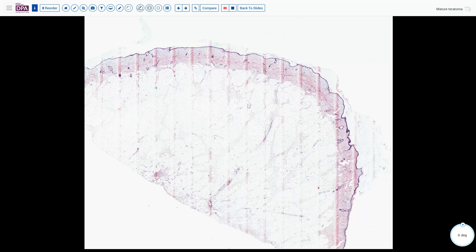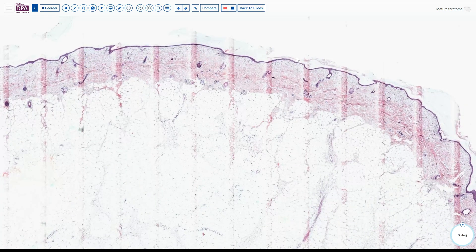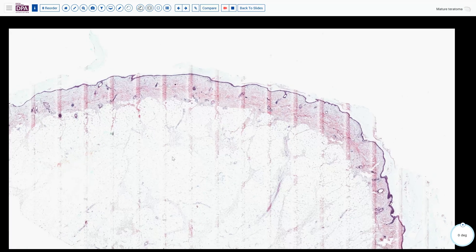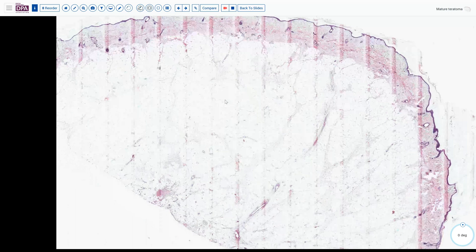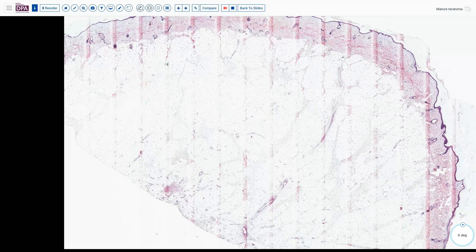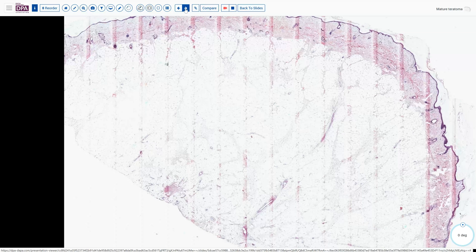This is a section from the large ovarian mass — an almost 40-centimeter mass — which as we can see shows a squamous epithelial lining and a fatty pedicle beneath that. Although two sections were submitted, we didn't see anything more worrisome than this on frozen section. So a mature teratoma diagnosis was rendered, and hopefully the patient does well.